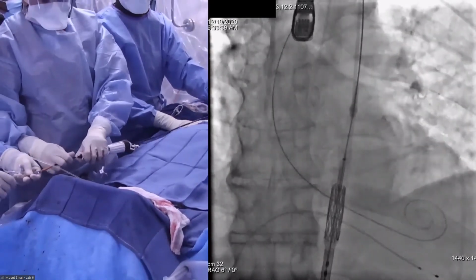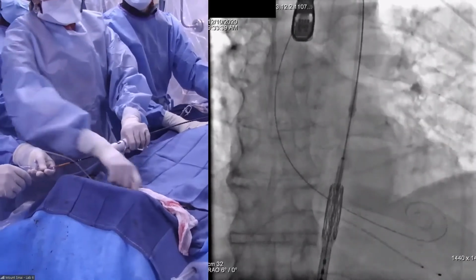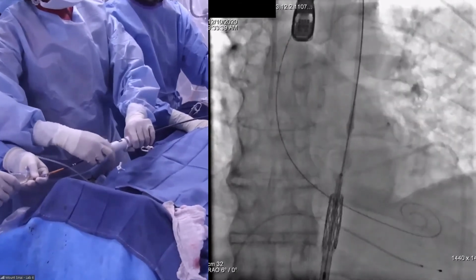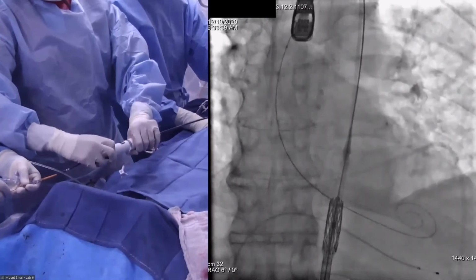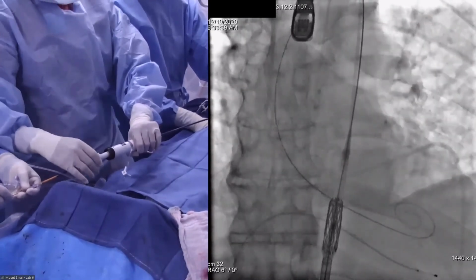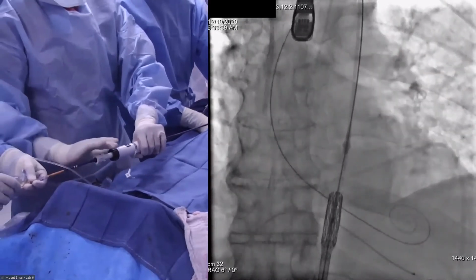You see the... please show that, come down, fluoro, exactly. Lock it, and then you still keep doing it with the fine small wheel. You see here, fine adjustment. Yep, the distal marker of the balloon is inside. Now it's completely loaded. Lock, unlock, just to make sure there's no tension.